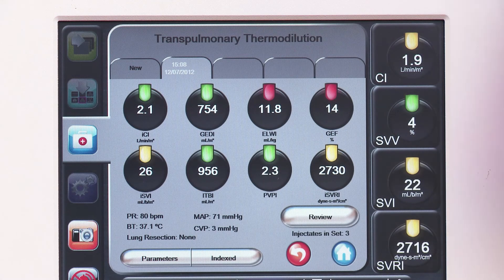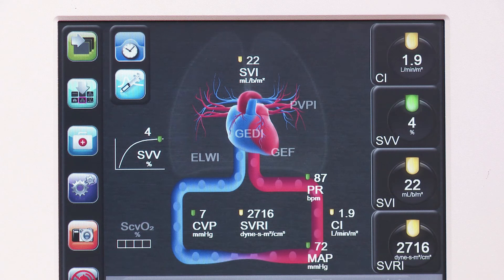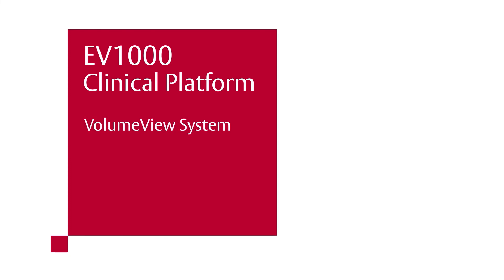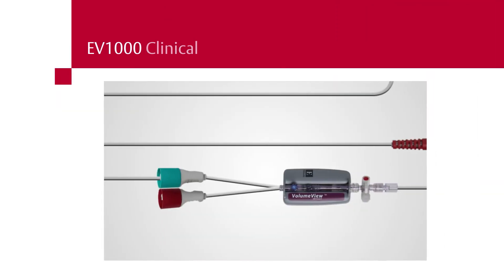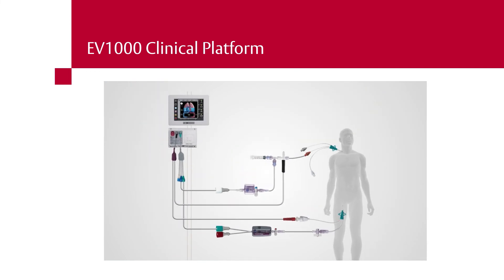Once Accept has been selected after editing the boluses, the continuous arterial pressure-based cardiac output will be calibrated, and only the continuous values configured for display on the monitor will appear. The EV1000 clinical platform, when used with the volume view set, offers a complete, unified monitoring system that provides a holistic view of clinically validated parameters. Experience what you need, when you need it, with the EV1000 clinical platform from Edwards Life Sciences.